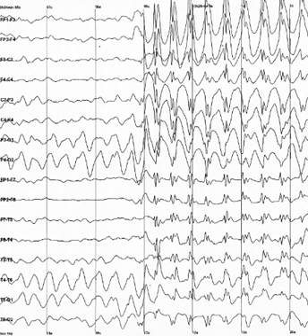The recording of these signals is referred to as electrocorticography (ECOG), subdural EEG (SEEG), or intracranial EEG (ICEG), all terms for the same thing. The signal recorded from ECOG is on a different scale of activity than the brain activity recorded from scalp EEG. Low voltage, high frequency components that cannot be seen easily or at all in scalp EEG can be seen clearly in ECOG. Further, smaller electrodes which cover a smaller parcel of brain surface allow even lower voltage, faster components of brain activity to be seen. Some clinical sites record from penetrating microelectrodes.